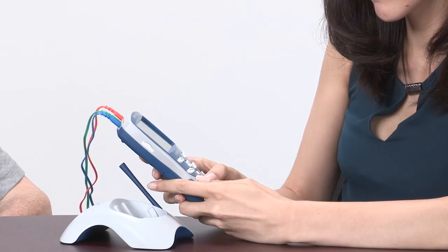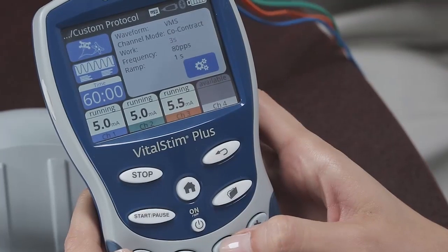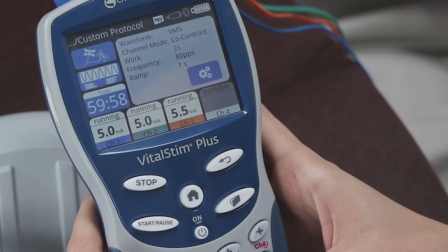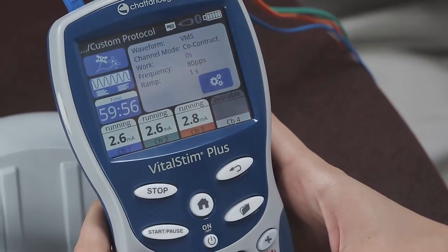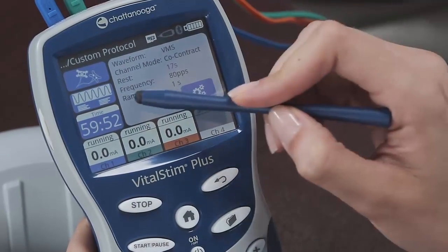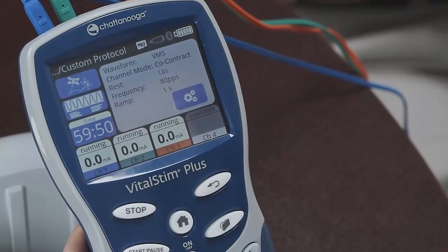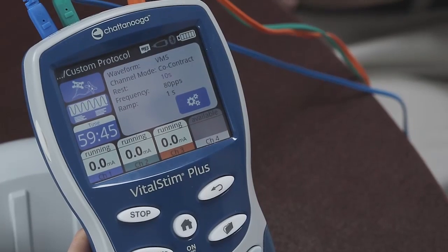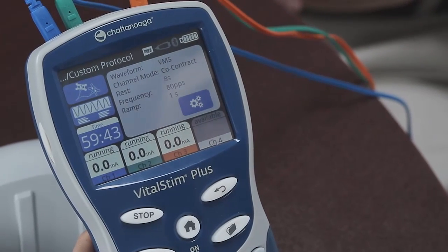Now when you watch the screen, you can see that the patient is about to start working as the rest cycle finishes and scrolls down to 0. As soon as the rest cycle hits 0 seconds, the work cycle will start. The therapist instructs the patient to start working and swallowing. That will go on during the stimulation time.